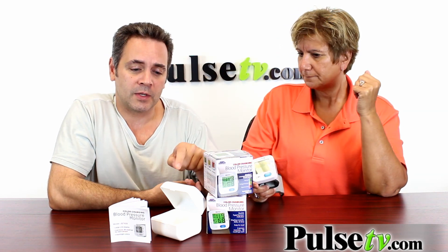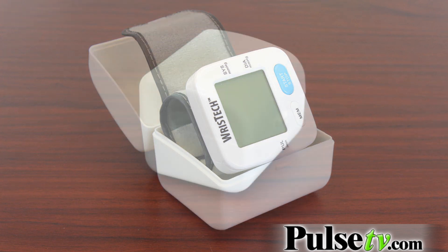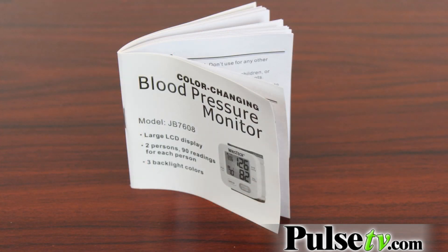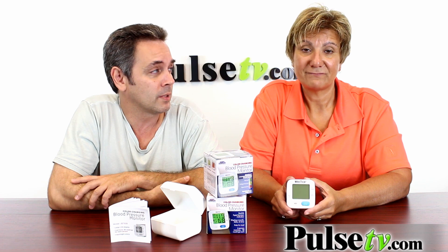When you buy this, you also get a hard case, which is convenient for carrying the thing around, and it also comes with an instruction booklet — but this is mostly how to set the time, how to set the date, how to save your readings. Like I mentioned earlier, it's only two buttons, so it's really easy to use.